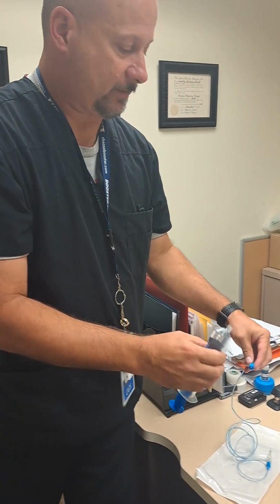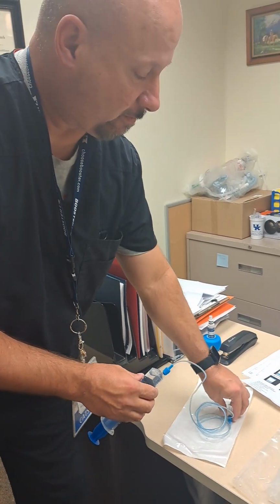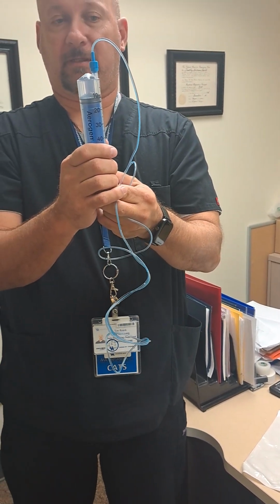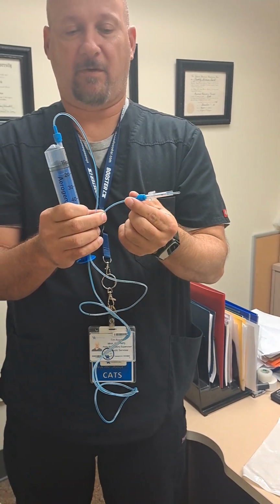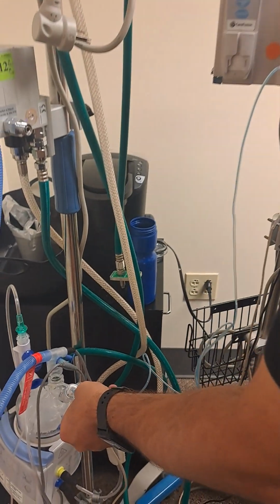Then we connect this to our administrating line by screwing it on the end. And just a reminder, you will want to prime this line with some albuterol, which I already have primed a little bit. Okay, you want to make sure you get albuterol all the way to the very end of it. All right. Then this part is what actually screws onto your Aerogen, as such.